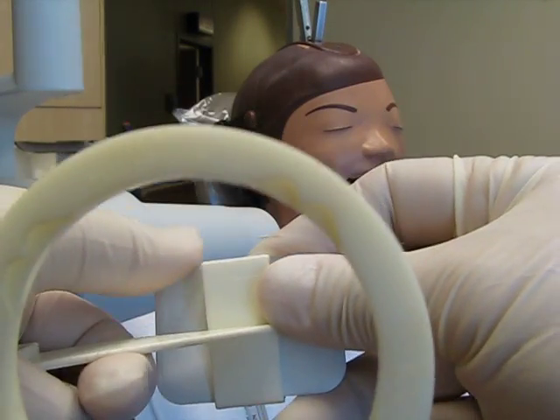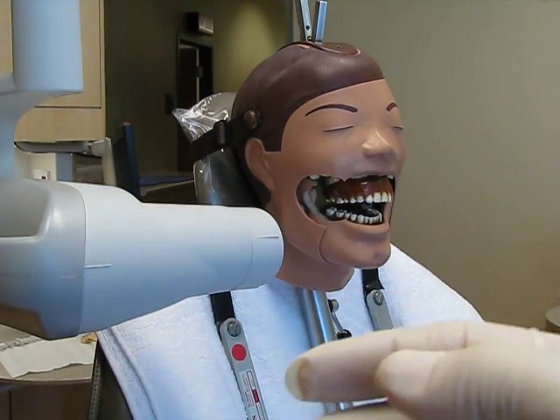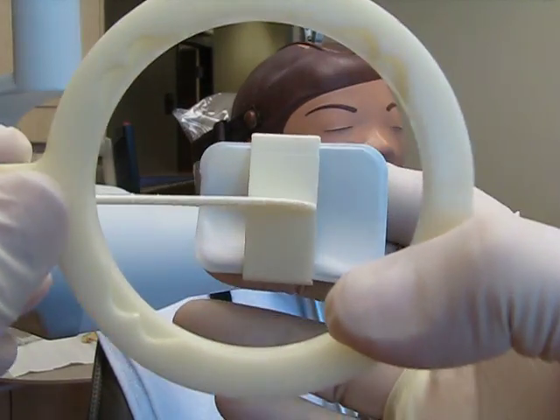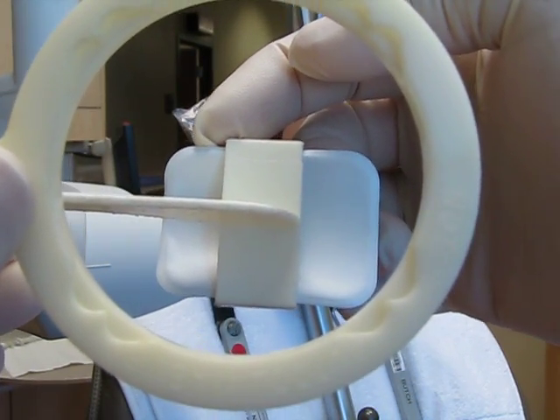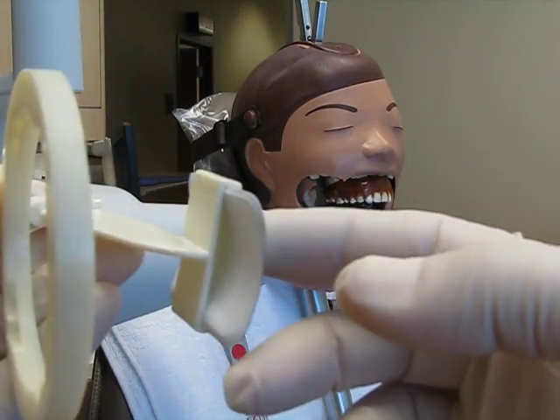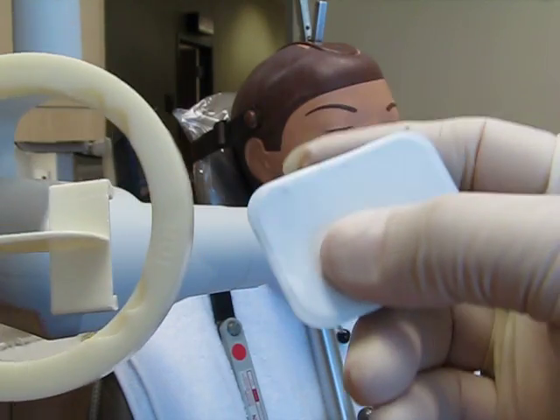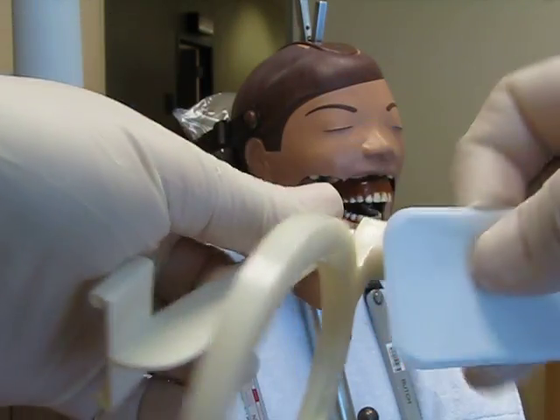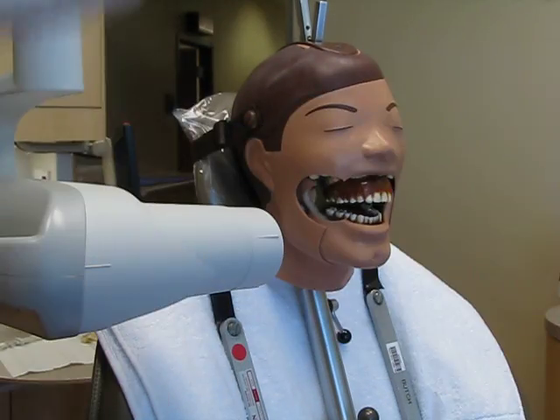For the left side, you have to position it in the orientation that you're going to do, okay? So the left side, if it was coming in like this, the dot would be at the top, at the upper maxillary mesial part of the film. So this will be the mesial, the distal, okay? If it were going to be for the mandibular, then the dot, okay? Again, let's orientate it the way it would be coming in mandibular. Okay. Would be now towards the bottom.